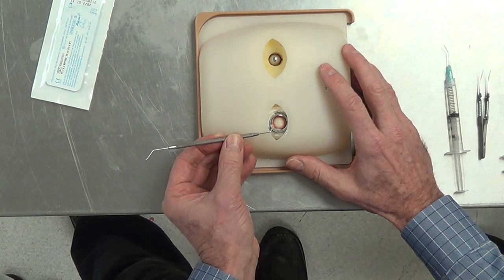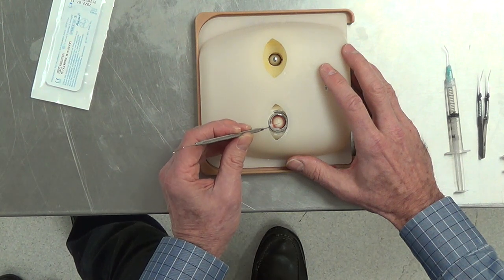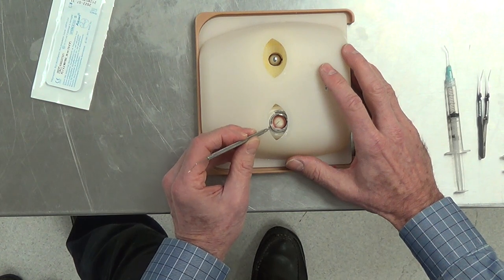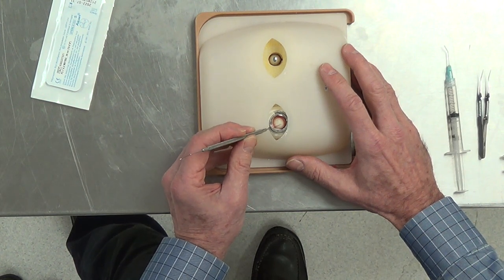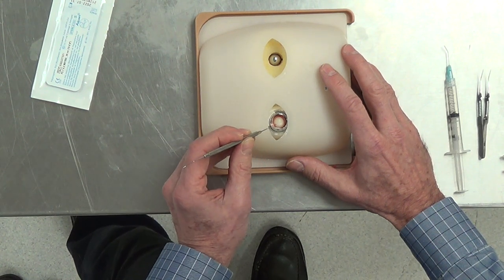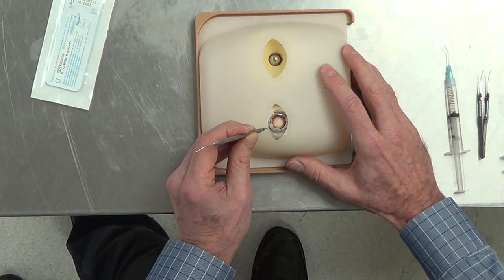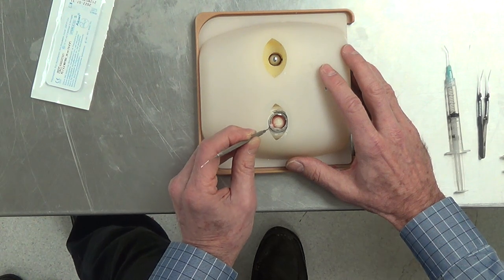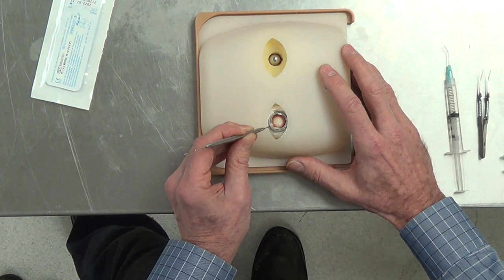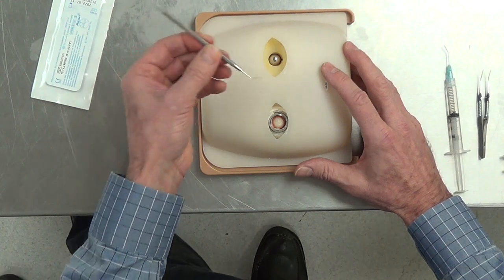I'm going to go in first, and then turn vertically, holding the instrument with three fingers like a dart so that I can manipulate 360 degrees, and especially sub-incisional. When you're doing sub-incisional, you have to be able to pivot on the wound and manipulate the instrument so that you're pivoting on the wound. I'm not moving the eye. If I want to go from here to here, I rotate the instrument — I want to be able to do it in all different directions and use both hands.